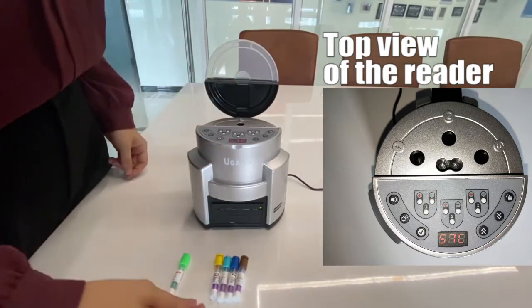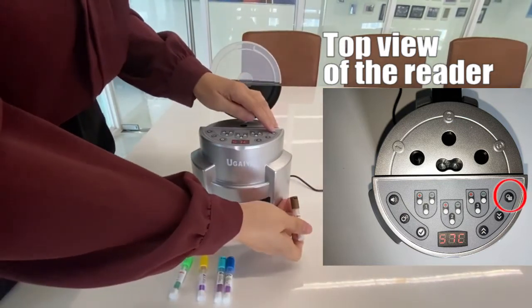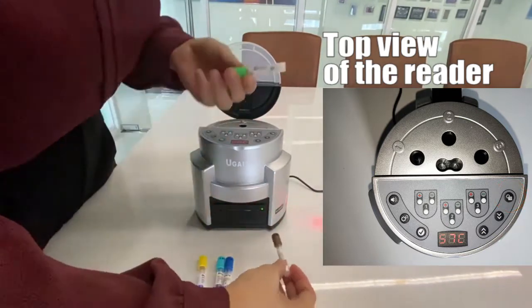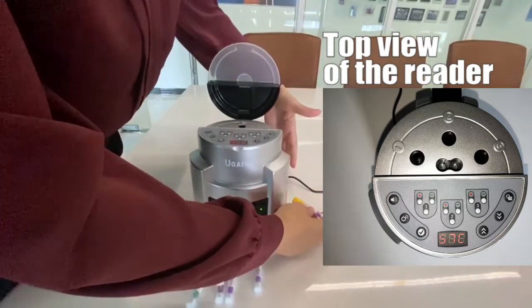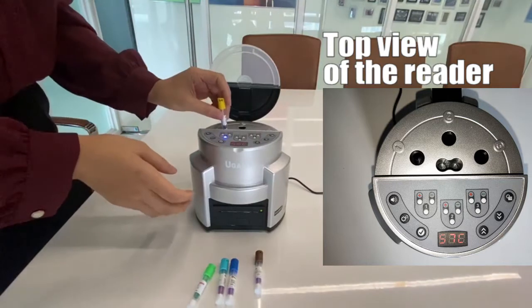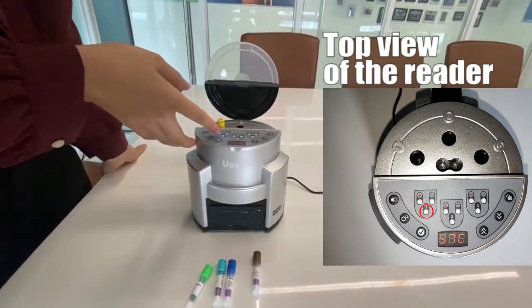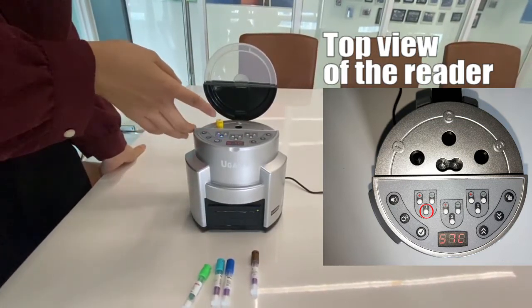Let me introduce how to use it. First, press this for scanning the barcode. Let me try the 20-minute VHP BI. Number one slot — the light is on. When you see the light is blinking, that means the incubation is on.